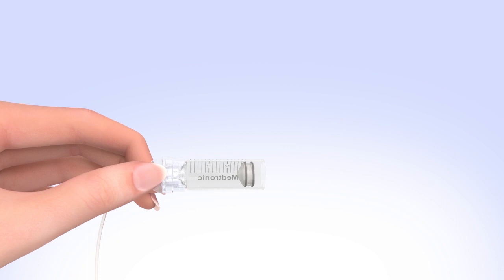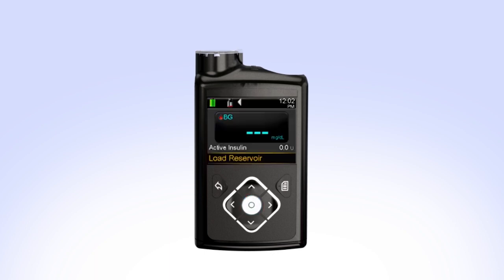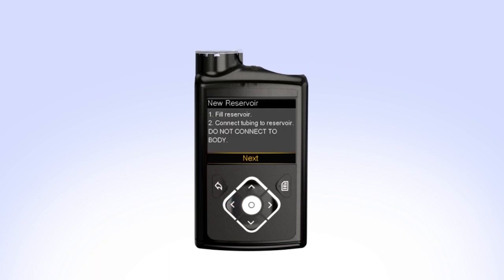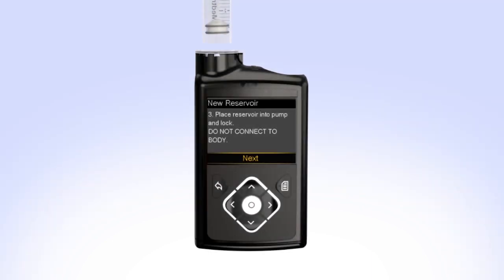Pick up the pump to review the next step on the screen. While you are filling your reservoir, the backlight may have turned off — press any button to turn the screen on again. If your pump is locked, select Load Reservoir. You will see the Unlock screen. Press the arrow that is highlighted to unlock the pump and continue to the next screen. The New Reservoir screen appears. Since you have already filled the reservoir and connected the tubing, select Next. The next step on the screen instructs you to Place Reservoir into Pump and Lock. You should have already rewound the piston in your pump and should not have the set connected to your body when performing this step. Put the reservoir in the pump and turn the tubing connector clockwise until you feel the reservoir lock into place.